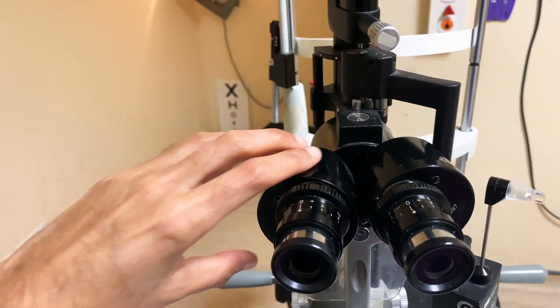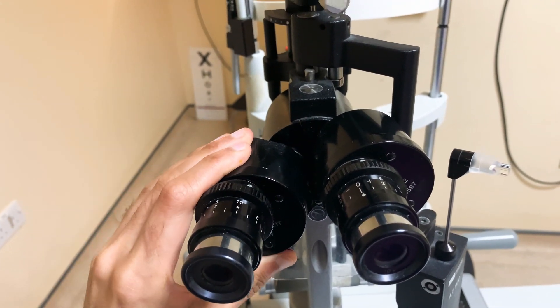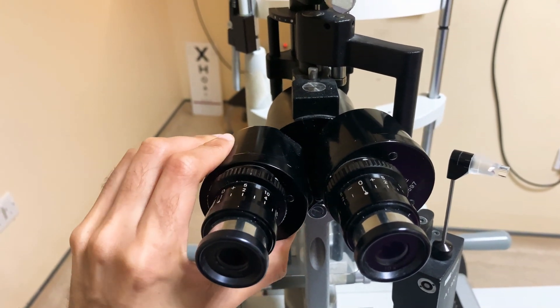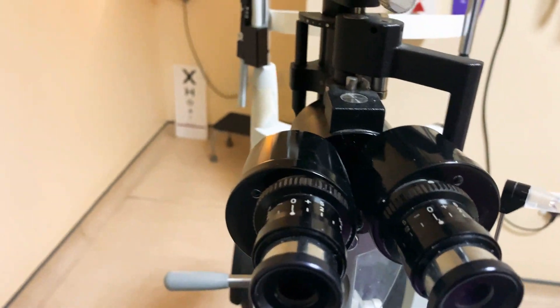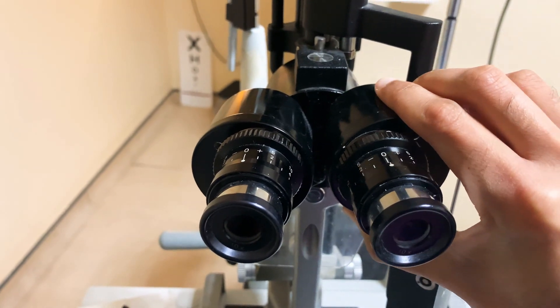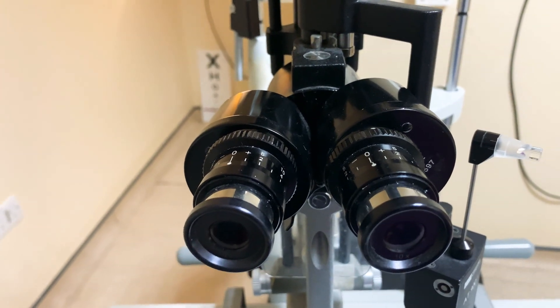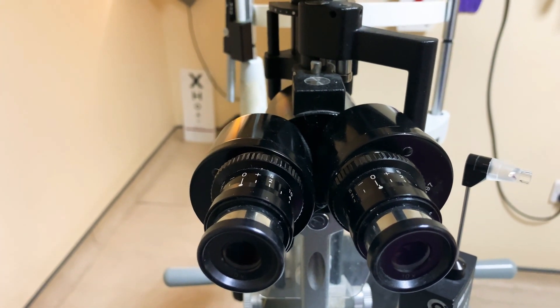The second thing: you need to make sure that you've got the correct interpupillary distance. That means looking through the eyepieces and adjusting them — each individually and at the same time — to make sure that the view you're seeing through the slit lamp is with both of your eyes, not just one. You need a binocular 3D view to really appreciate what's going on.